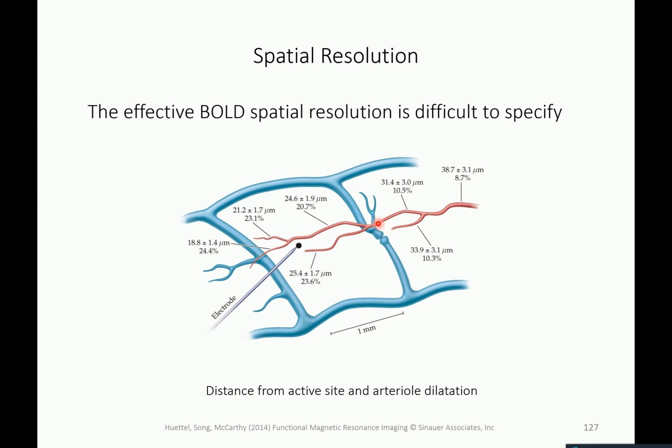The spatial resolution that you have in terms of voxels is not necessarily what you get in terms of functional activation. Typical things that you see in cognitive neuroscience studies are fMRI studies where the blobs you have after all the data analysis are around 3 to 4 millimeters in diameter, that you really believe are something. If they're really small and kind of everywhere, and usually quite weak, then you don't quite believe it. So 3 to 4 millimeter blobs, that's what you get out of fMRI in the end.